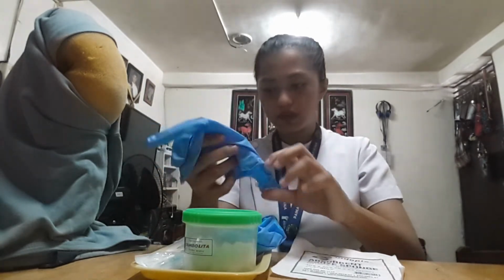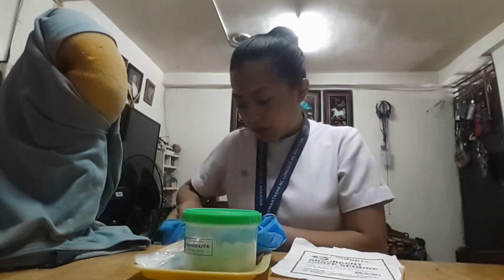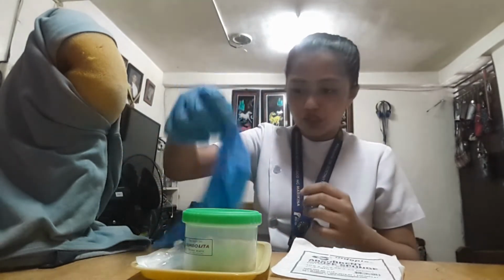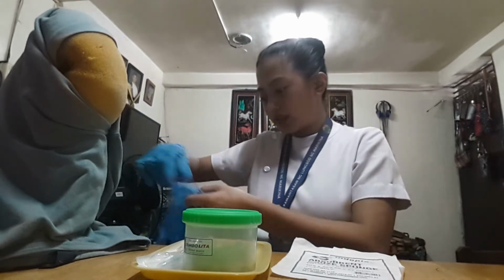Next, I have to apply clean gloves. It is important to have clean gloves to prevent cross-contamination and spreading of microorganisms from patient to nurse and vice versa, from nurse to patient.